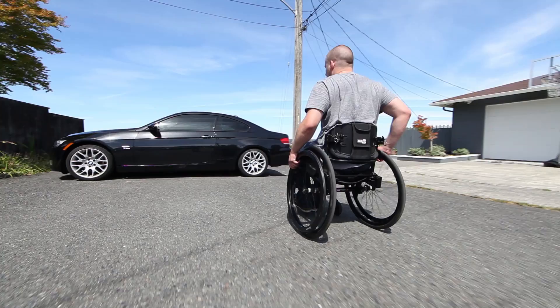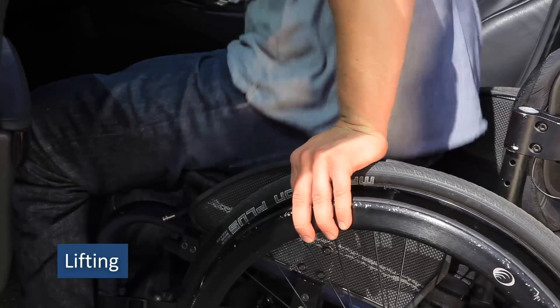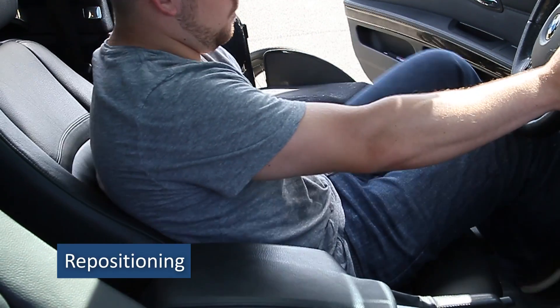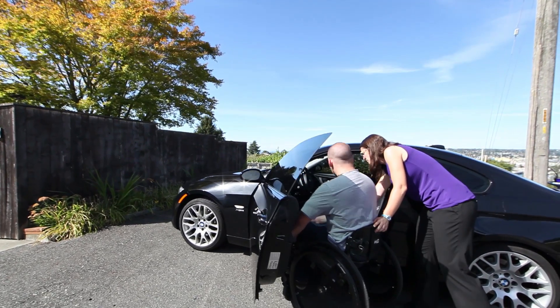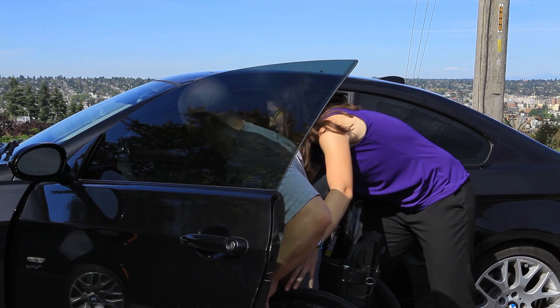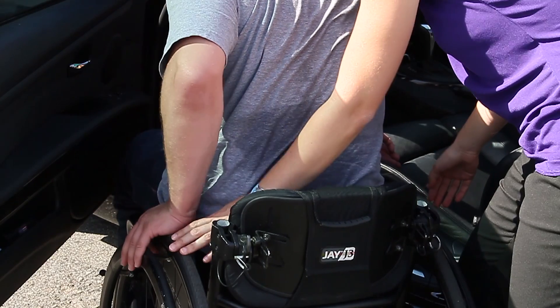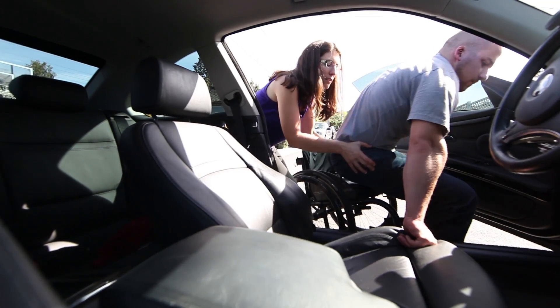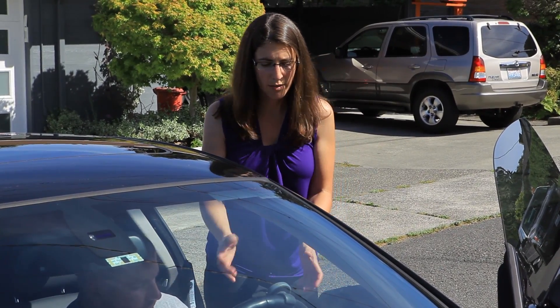This transfer involves three phases: setting up, lifting, and repositioning. When you're first learning how to move between your wheelchair and car, take advantage of the skills of a spinal cord injury trained physical or occupational therapist. These therapists can help customize your technique and spot you until you can do them on your own. The therapist can explore options for loading your wheelchair in the vehicle.